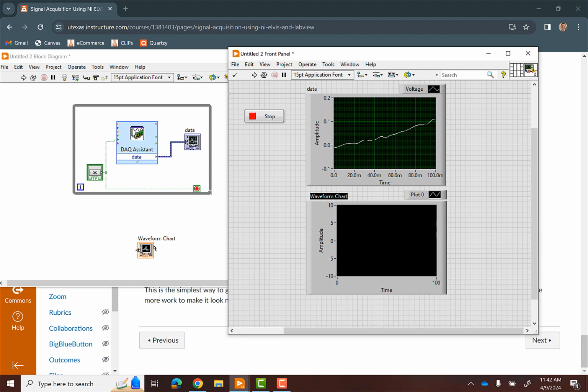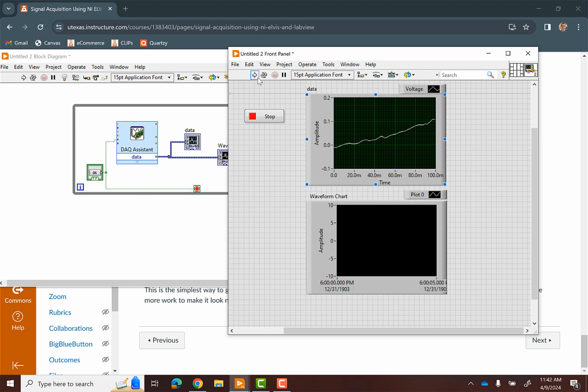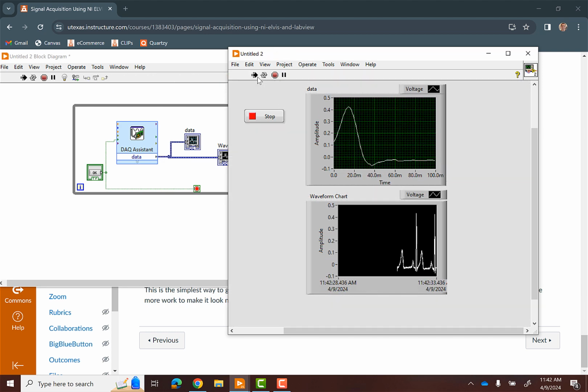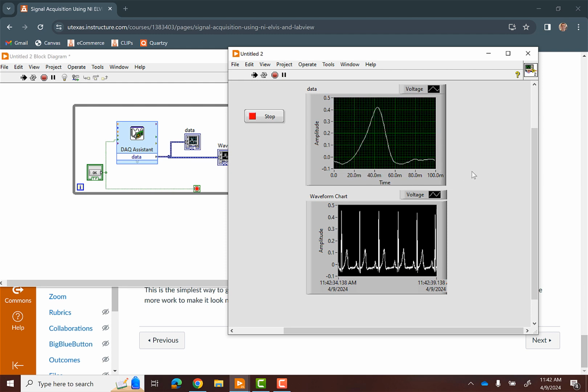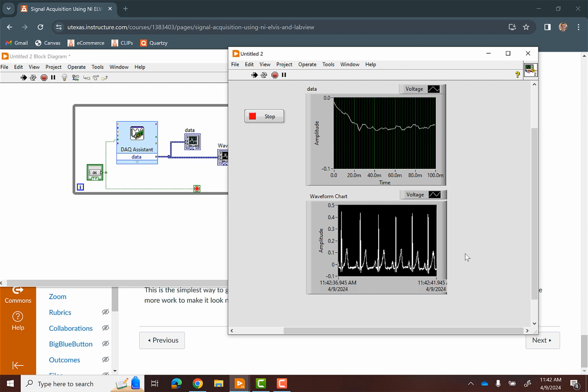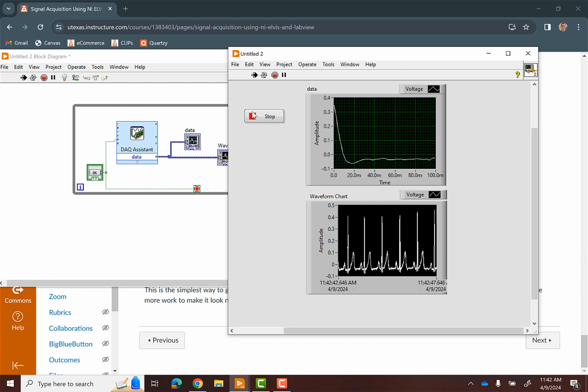And then we need to put our waveform chart up in the block diagram as well, right? So I'm gonna make this while loop a little bit bigger and drag this up here. And now we want to wire the data for the waveform chart into the same data that we're getting for the graph, right? So we can see them both together. So I'll do that, connects the chart up, and now I'll go ahead and just hit run. Right, so again, the graph is just showing some instantaneous 100 milliseconds at a time data. The chart looks much nicer. Okay, this is what we would want to see from our ECG signal. So that's good. So we can stop this.